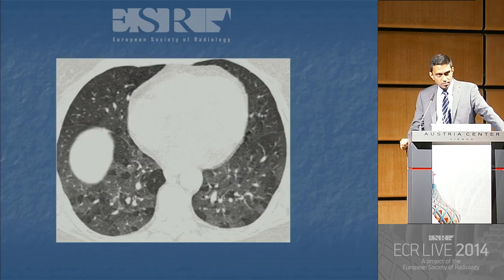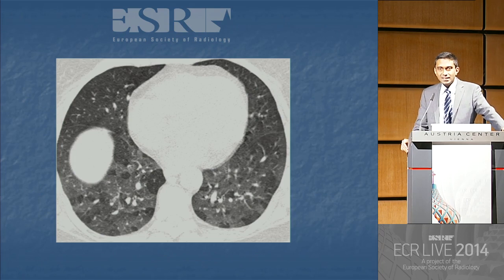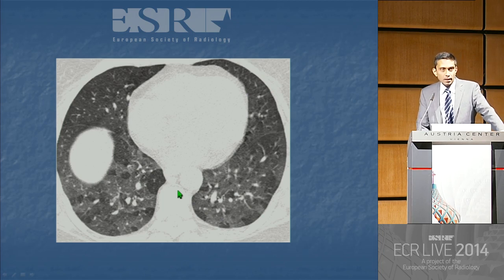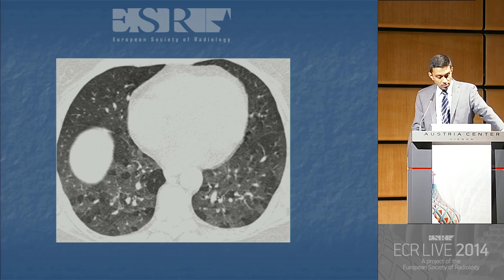So if I go back to this particular example I showed you earlier, the question to you is, do you think this is clinically significant? Well, certainly there are more than 5 pulmonary lobules that are air-trapped. There are quite possibly more than 25% of the lung involved here. And again, the way I would interpret this is by certainly raising the possibility of significant air trapping in my report, but it's up to the clinician to assess clinically, for example, whether the patient is symptomatic and correlate with their clinical history.